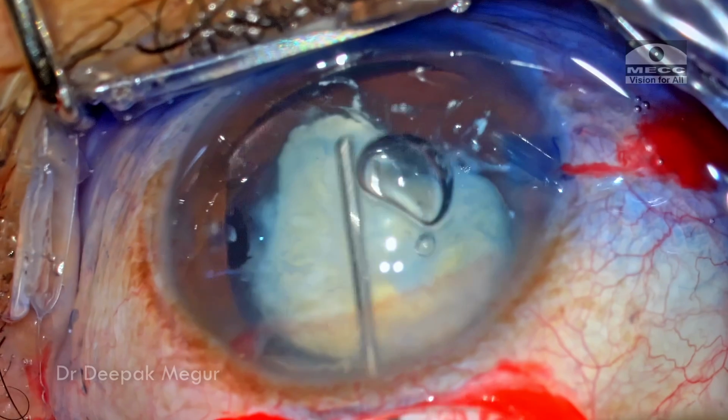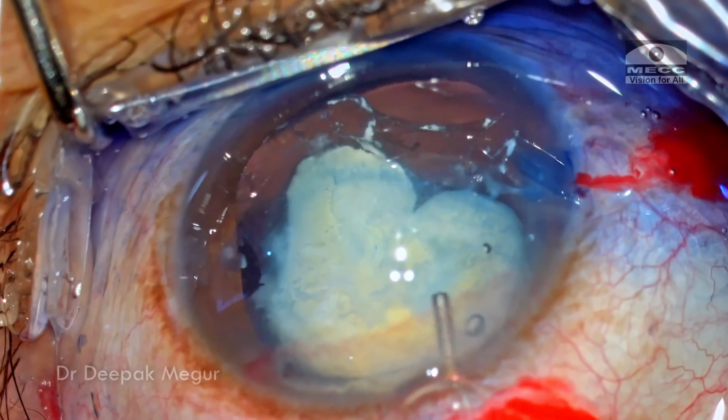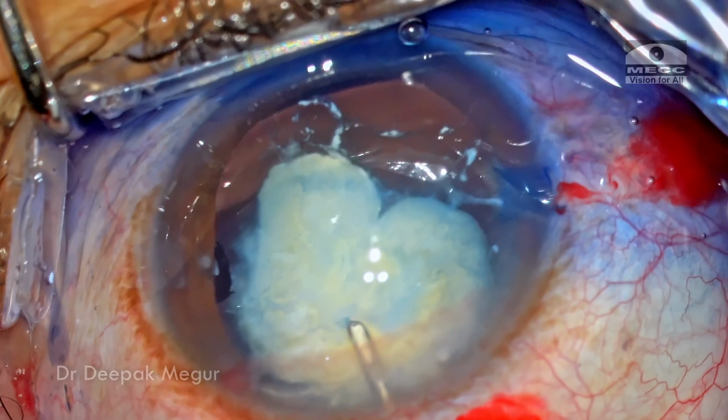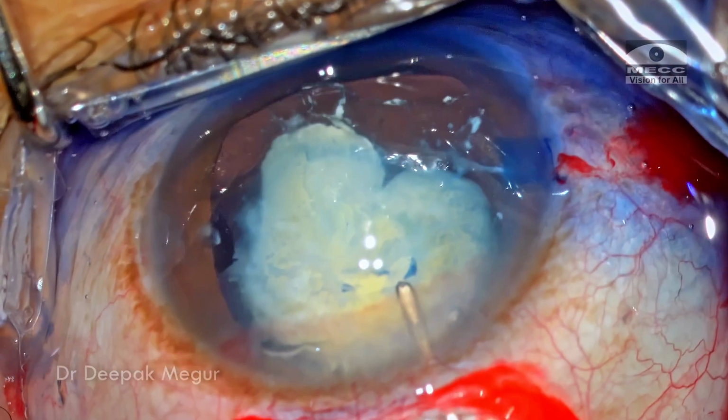Time to perform the rhexis. I'm planning to do an initial small rhexis, and then if it is successful, I plan to introduce the CTR and then maybe enlarge the rhexis. So I'm using a sharp cystitome to puncture the anterior capsule, and as I'm doing it, the entire lens is moving.